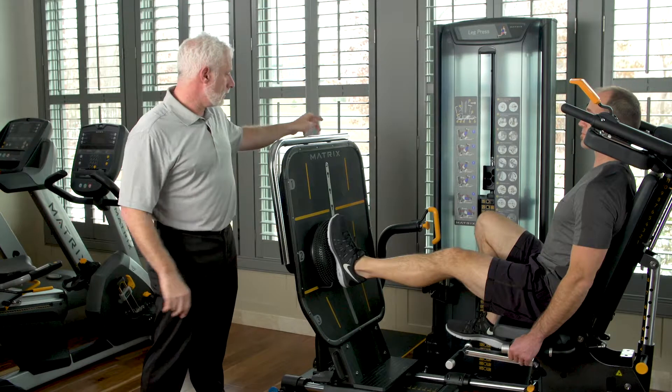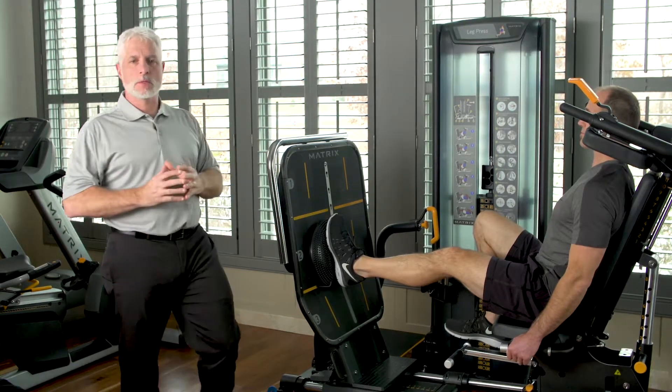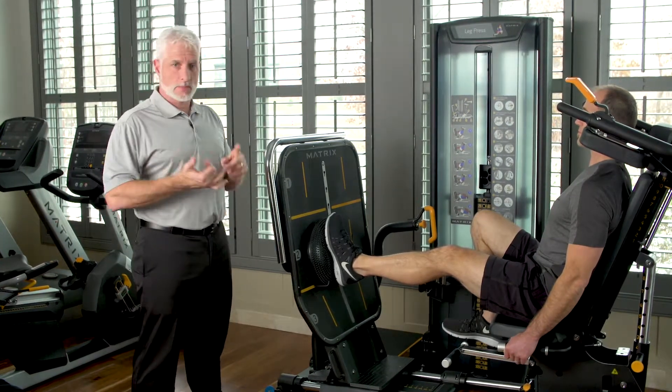Or he can look at a dot right on the top of the leg press. Because what you're doing is challenging the muscle system, but you're also gaining strength and stability for walking, for strengthening, and for functional activity.